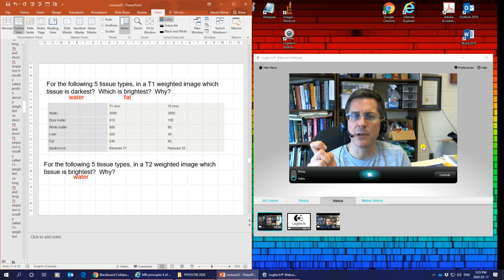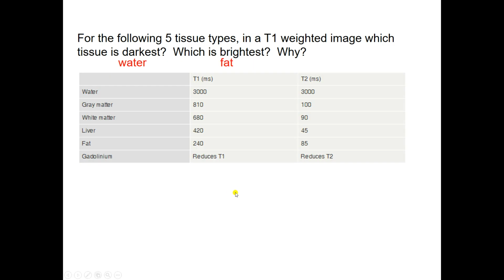The water is real slow. This is this idea of saturation, spin saturation. It's trying to recover longitudinally. It hasn't recovered yet. You hit it with another pi by 2 pulse. It's like, crud, I'm not ready to go yet. It just can't recover. There's no signal. It's very dark. You have not let it relax that way.